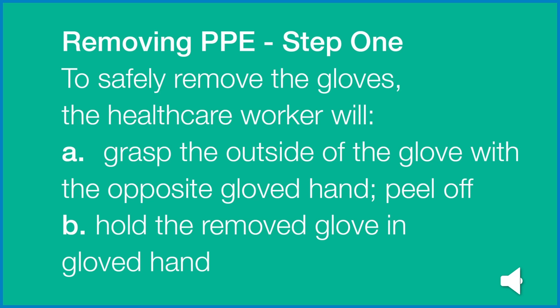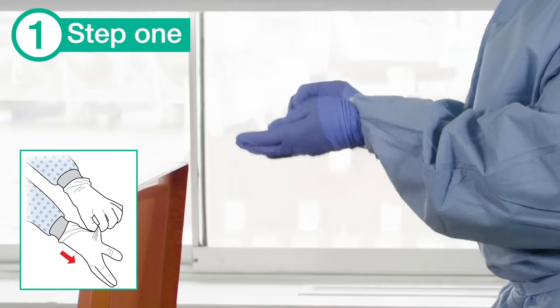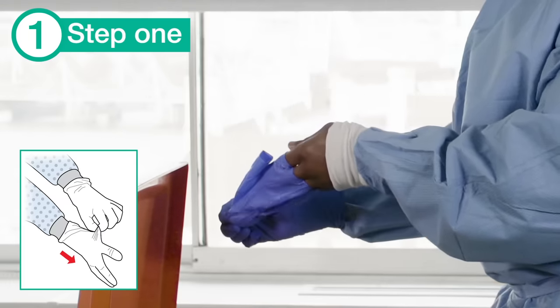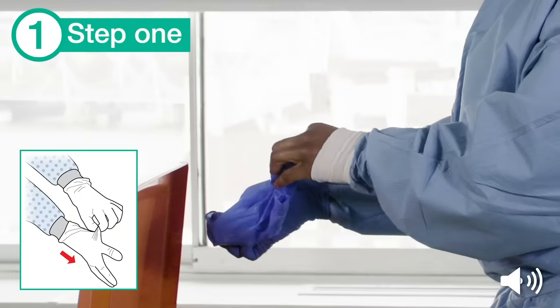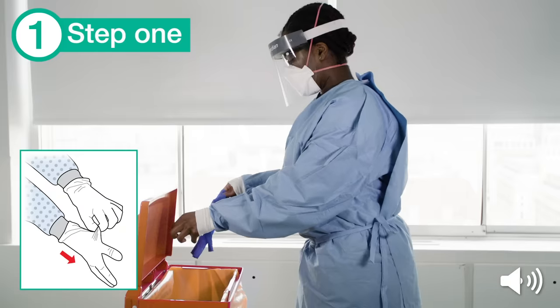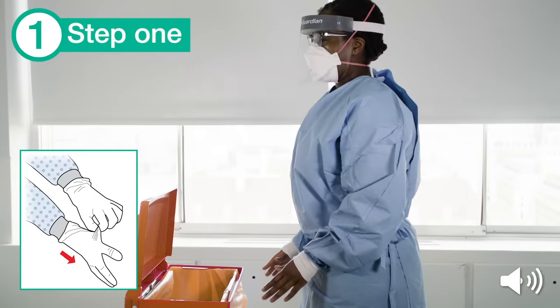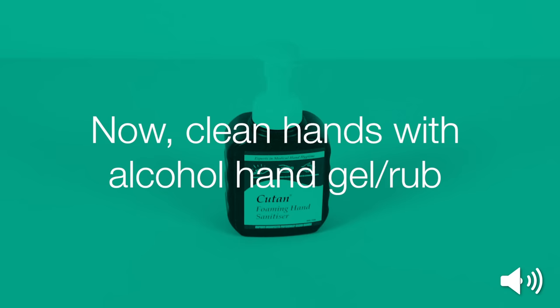Removing PPE Step 1. The outside of the gloves are contaminated. To safely remove the gloves, the healthcare worker will grasp the outside of the glove with the opposite gloved hand and peel off. Hold the removed glove in the gloved hand. The healthcare worker now slides the fingers of the ungloved hand under the remaining glove at the wrist, then peels the remaining glove off over the first glove, and disposes of the gloves in the clinical waste bin. Now clean your hands with alcohol hand gel or rub.